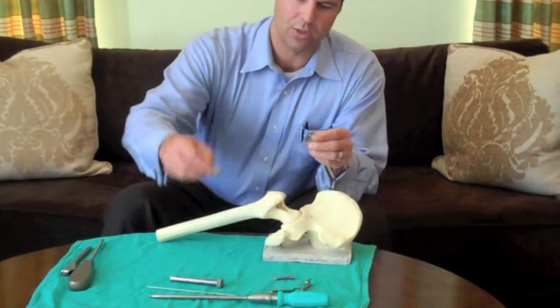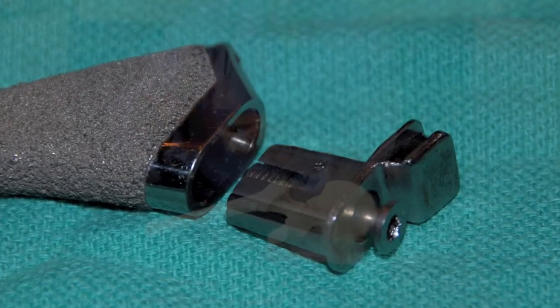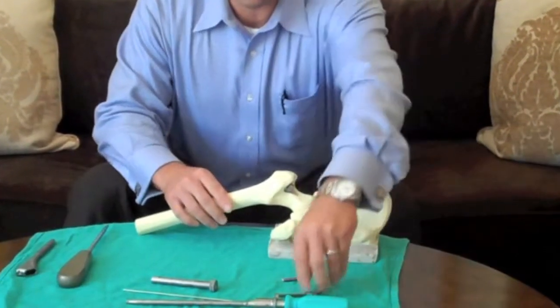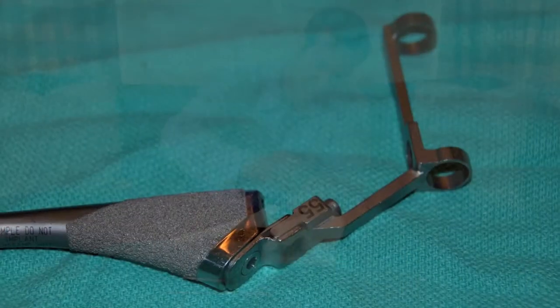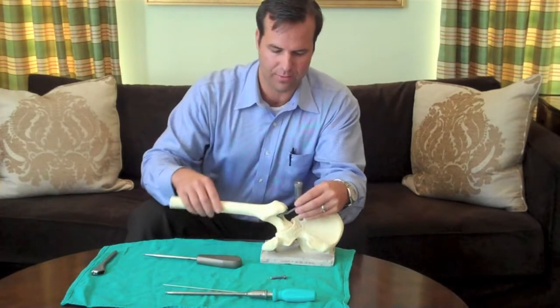The modular connector here just threads into the modular pocket of the femoral broach or femoral prosthesis, and then once that's implanted, the surgeon just implants the femoral broach to the desired level, and then the femoral screw guide screws into the modular connector. This femoral screw guide is used to insert a guide wire perpendicular to the axis of the femur.